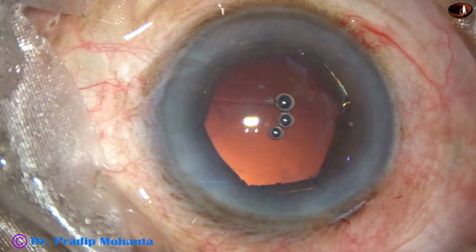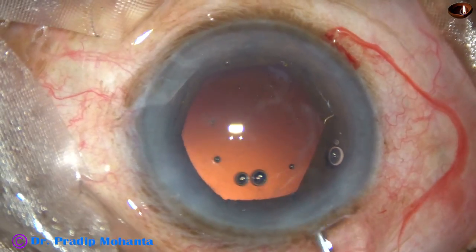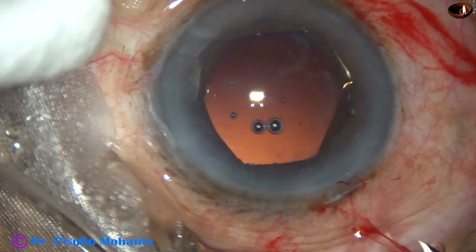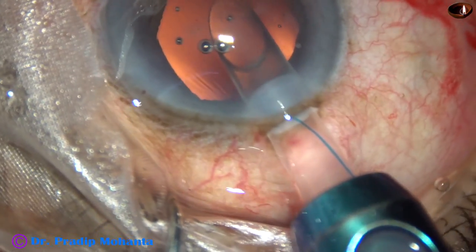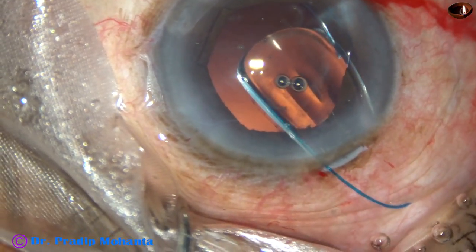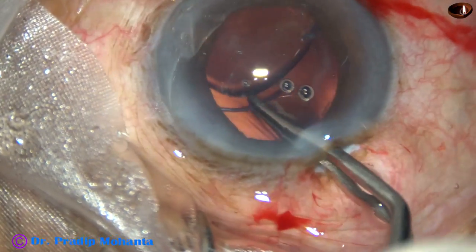Now, implantation of the intraocular lens. These cases may have posterior capsular rents during emulsification of the last piece, so it is always better to select a multi-piece intraocular lens that can be placed in the sulcus. I have enlarged the main wound to about 3.1 mm using a B cartridge, going inside the anterior chamber. This is a Tecnis multi-piece intraocular lens from Abbott Medical Optics, now Johnson & Johnson. The leading haptic has gone into the capsular bag and the trailing haptic is placed in the bag with McPherson's forceps.